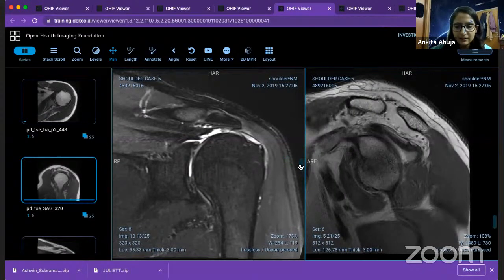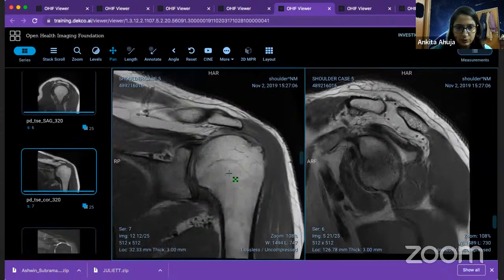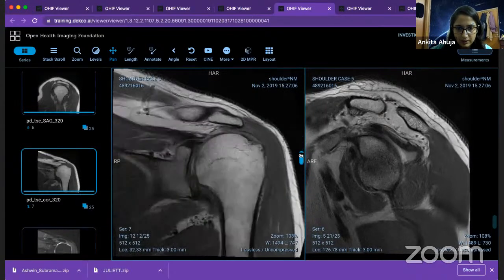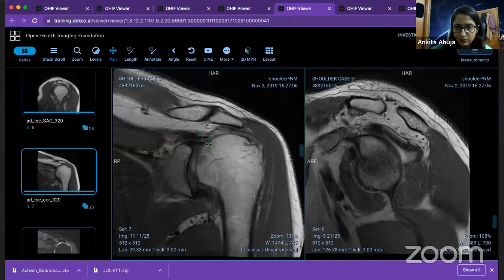So like you guys clearly said, and you were perfectly right. So showing you on this. Your supraspinatus should insert somewhere over here, and you see the tendon lying over here. So you usually measure how much it's retracted. We measure that so that it gives you an idea how bad the tear is, how much it's retracted, will you be able to pull it back or you need to do a medialized surgery. So all that way you will be guided through this measurement. So this is telling you that supraspinatus is torn.